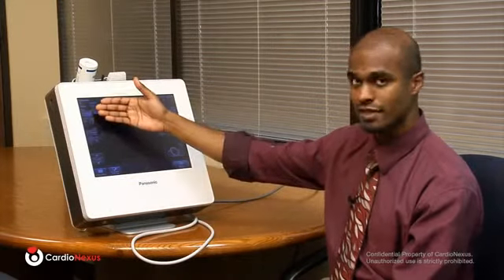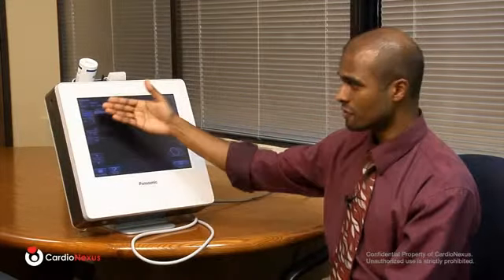The first option is a plaque scan, so per the ASE guideline, we do want you to visually look for any obstructive plaque in both the right carotid and the left carotid. Once you've completed the plaque scan, you'll then move on to measure the carotid IMT, the intima media thickness. So we're looking at carotid artery wall thickness. So the advanced scanning procedure will actually be covered in a separate video. For this purpose, we will demonstrate very quickly using one of our volunteers here in the lab.